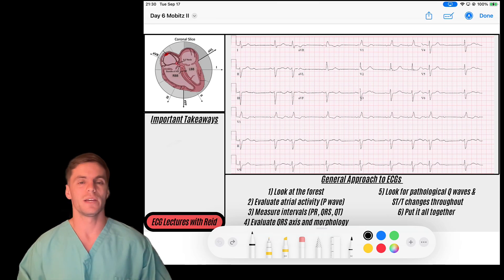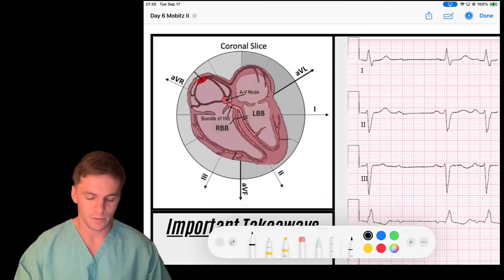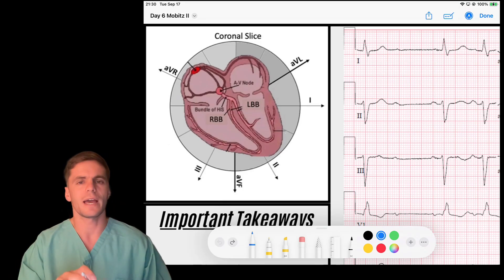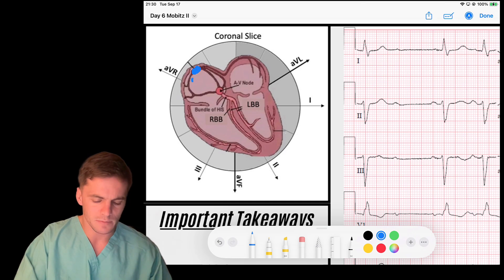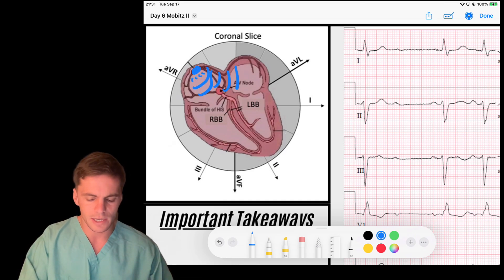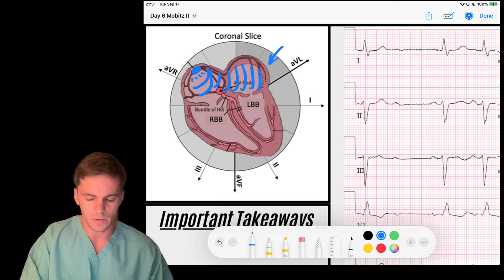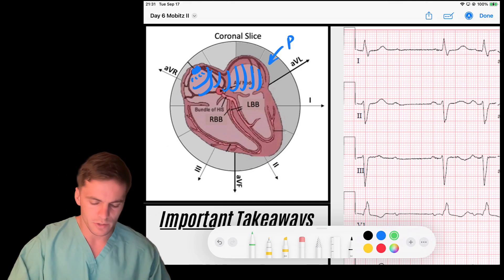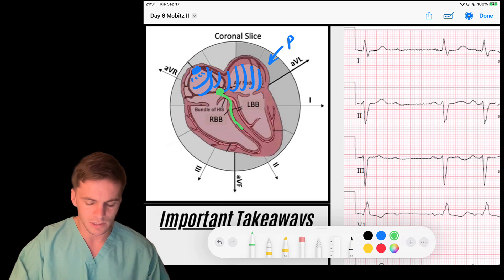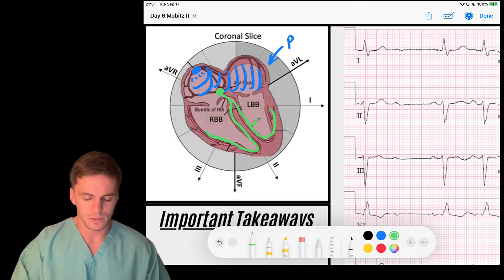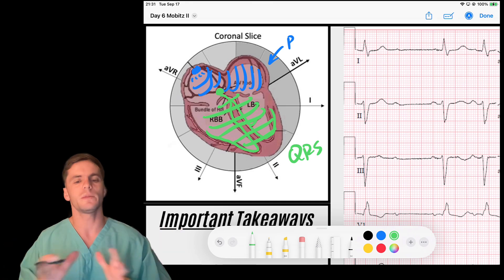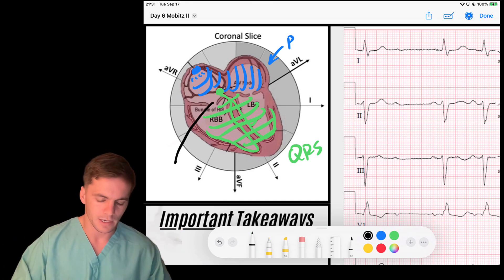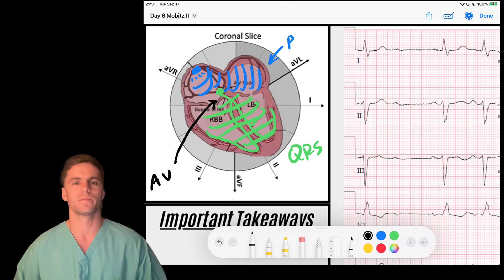Remember, to refresh our memory on AV blocks — we look specifically at the relationship between a P wave and a QRS. Sinus P waves fire off and depolarize the atria, creating our P wave. The AV node captures that signal, delays it, and then sends it down through our ventricular fibers to create our QRS. The time and spatial relationship between the P wave and the QRS is represented by this AV junction.